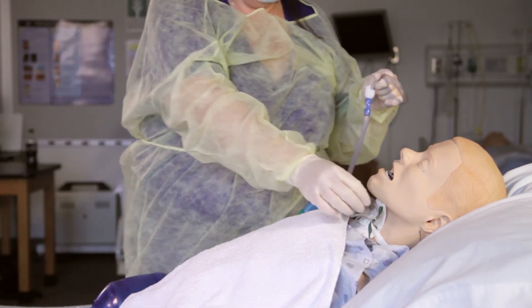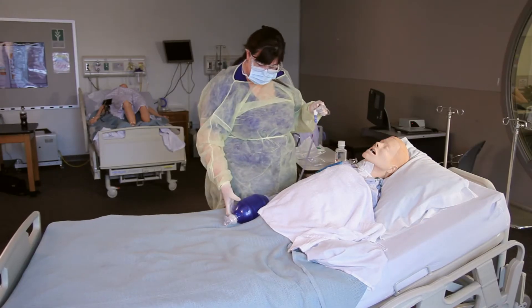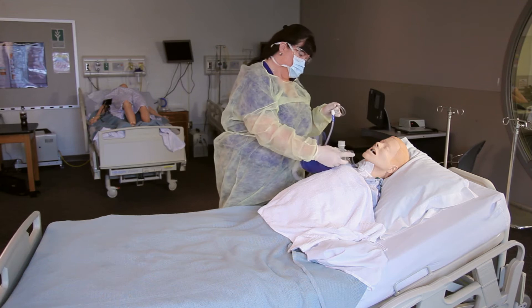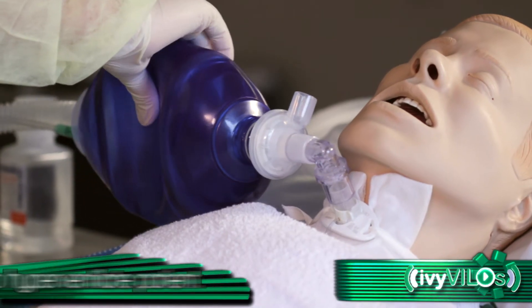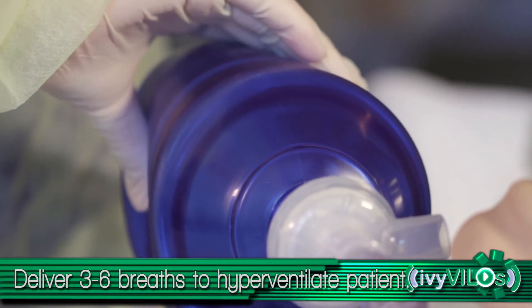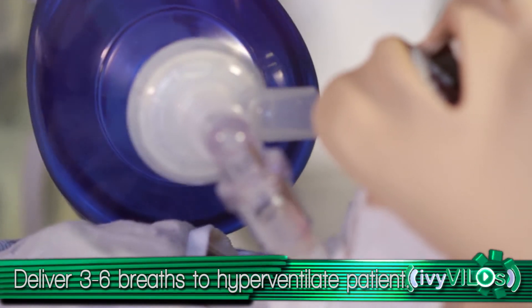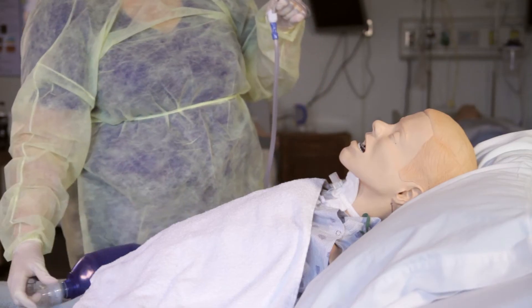Use your non-dominant hand to remove oxygen. Attach the Ambu bag to the tracheostomy. Hyperventilate the patient with 100% oxygen by delivering three to six breaths by squeezing the Ambu bag. Remove the Ambu bag from the tracheostomy.